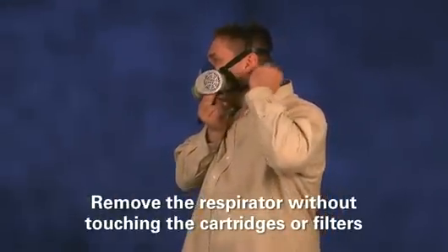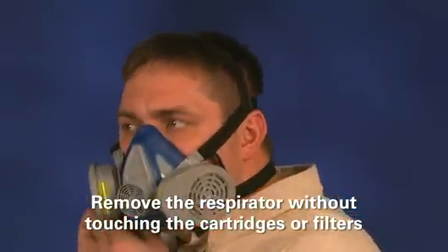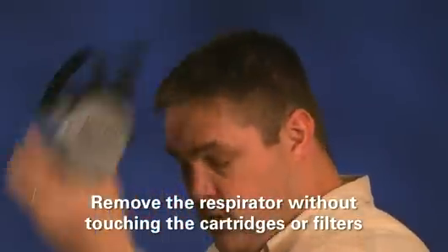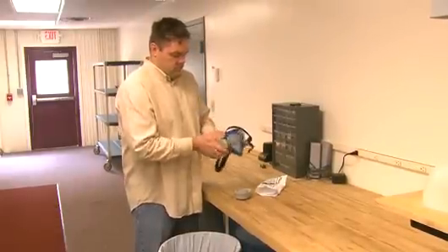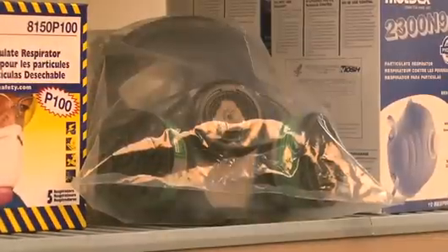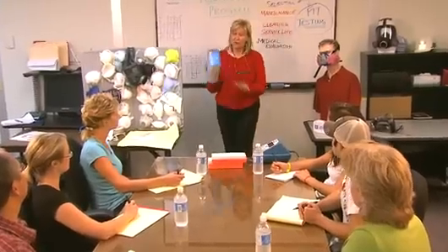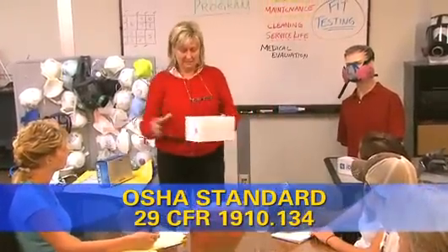When you have finished wearing the respirator, carefully remove it by loosening the straps and taking it off without touching the cartridges or filters because they may be contaminated. Follow your company's procedures for maintenance of the respirator, including proper cleaning, disinfecting, and storage. Remember, respirators must be used in the context of a comprehensive respiratory protection program, according to OSHA Standard 29 CFR 1910.134.